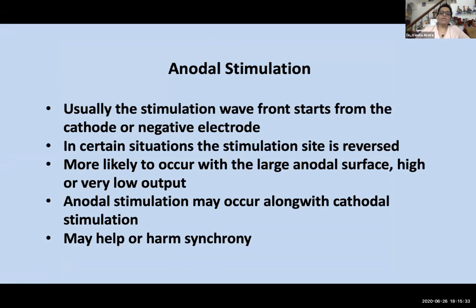Most of the time, the LV lead has been programmed in what we call the pseudo bipolar mode. Here the threshold of the LV will be okay, but in V1 the lead 1 will be positive. So what we can do here is to switch the LV lead into a true bipolar, rather than pacing between the LV lead as the cathode and RV as the anode.